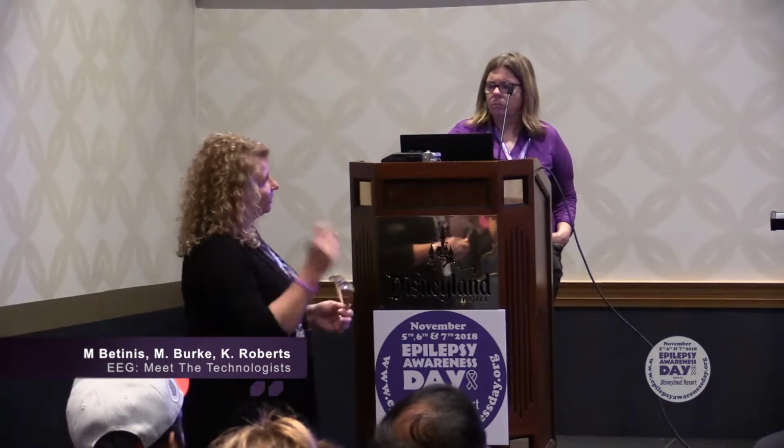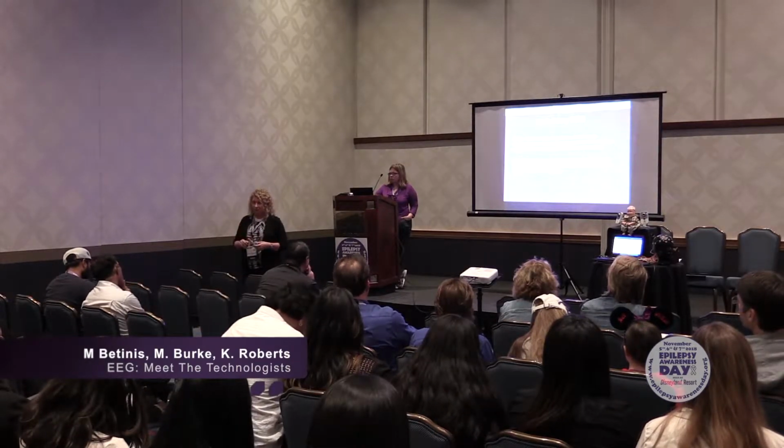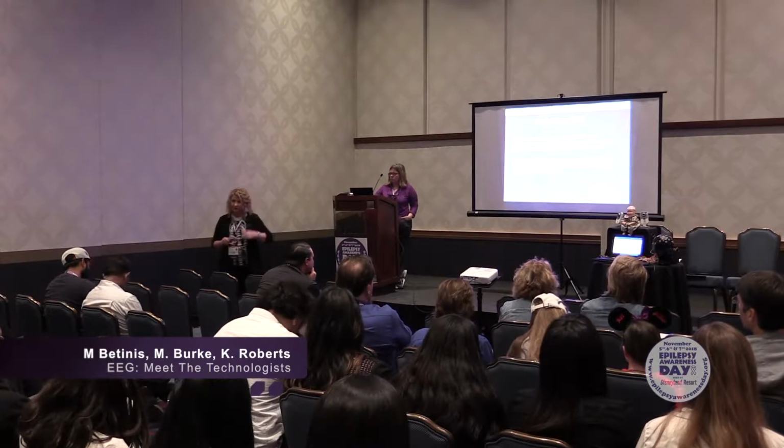Okay, so this is where I'd like to bring in Melissa when we start getting into the equipment. Some of you may have had ambulatory EEGs, and you may have had in-home care where a skilled technologist comes into your home and sets you up with video and EEG. Or you may go to your physician's office or wherever you go for your outpatient, and actually go home having all that equipment applied, right? So the electrodes on your way home.